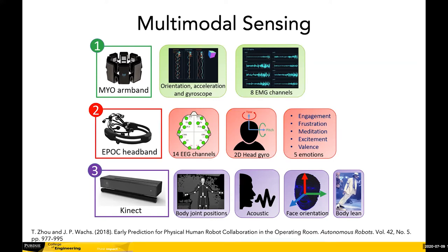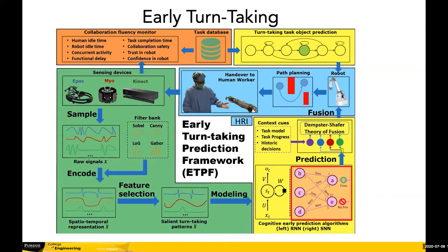We were able to come up with a very good solution about what instrument is needed, based on modeling the surgery. It was much more challenging to know when the main surgeon needed the instrument. So we came up with an interesting architecture which involved fusing all these modalities using feature selection and some interesting machine learning. But the key interesting finding was a new architecture for spiking neural networks to come up with a solution for turn taking. Turn taking is realizing at what point it is the turn of the nurse and at what point it is the turn of the surgeon.